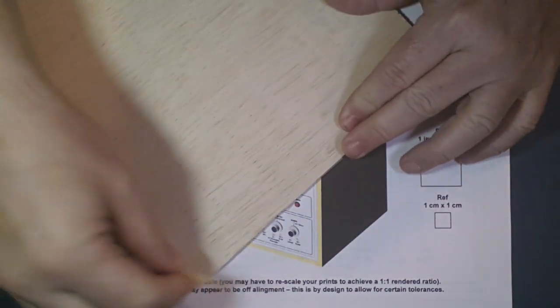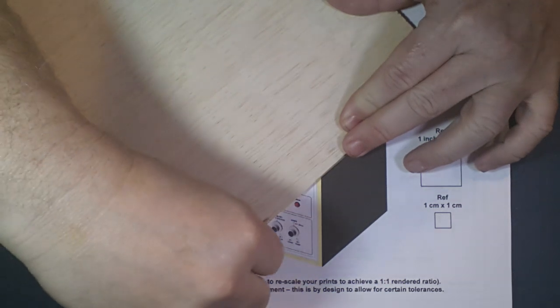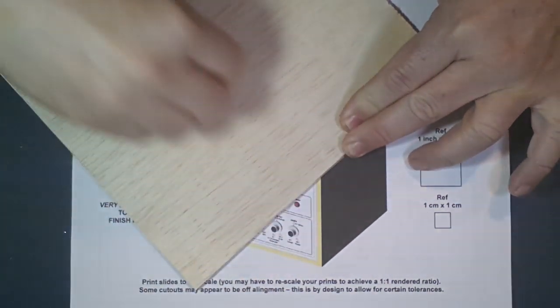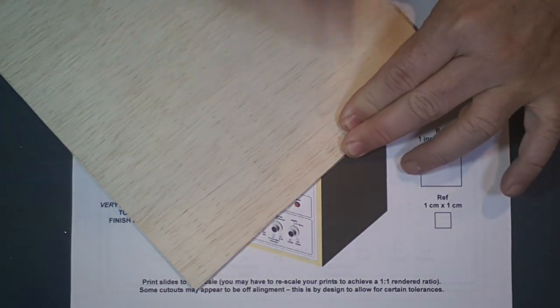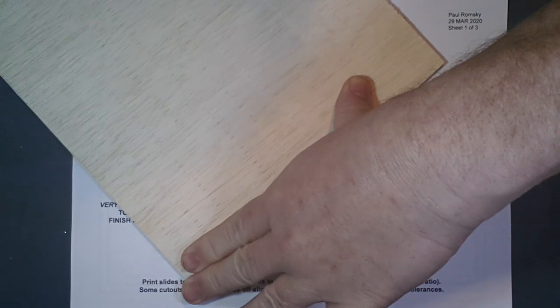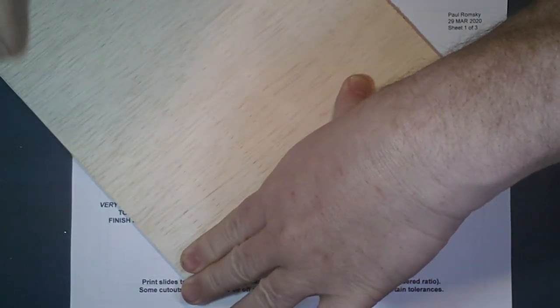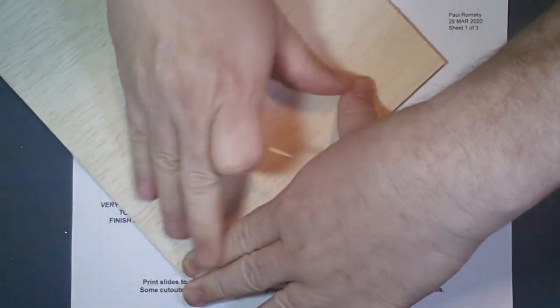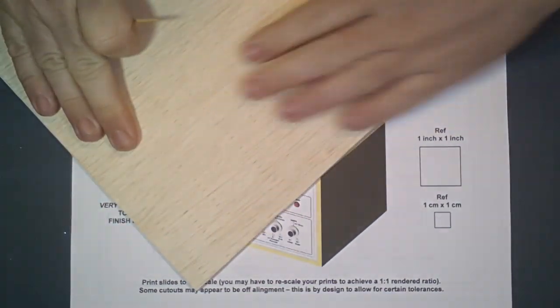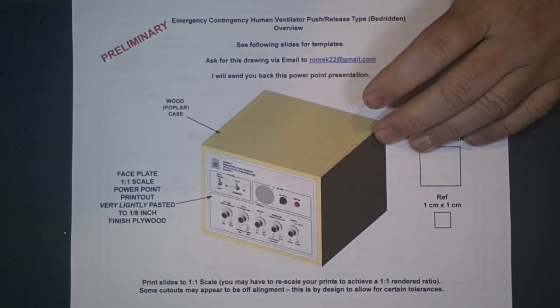So there's a trick where you have to get wood glue, and then with razor blades, I squeegee off all the excess. There's very little glue left, and you have to do it quick because it starts to dry. Then you lay the paper down, and hopefully you get it square enough. If you do a big enough board, you can always square it up on a table saw. And then you have to put books and stuff on it, and another piece of plywood over it, and flatten it down and let it dry for a few hours, and you'll get a perfectly nice panel.